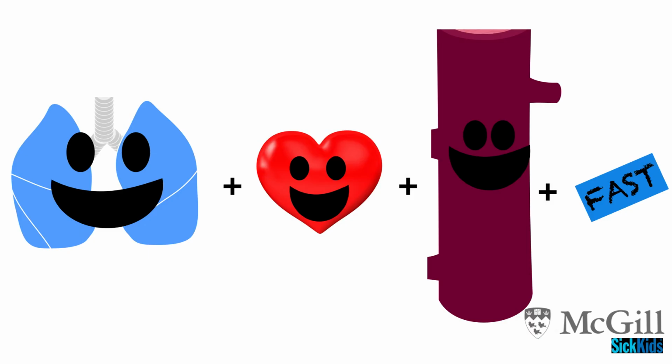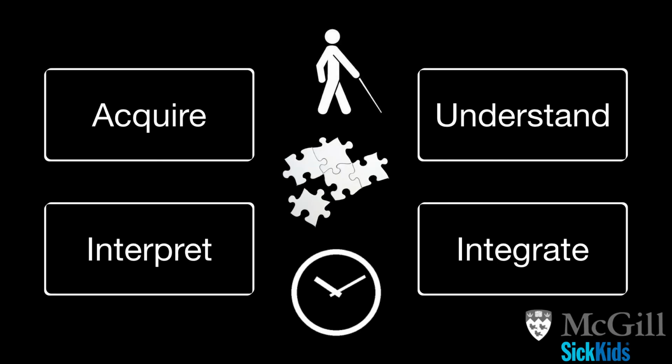In conclusion, we can say that once competency is achieved, the RUSH exam can be performed efficiently in children and can improve diagnostic accuracy, but more evidence is required to demonstrate impact on outcome. I would like to finish by saying that point-of-care ultrasound is only a piece of the diagnostic puzzle. You need to improve image acquisition skills in order to be able to interpret your images and understand their meaning within the clinical context.